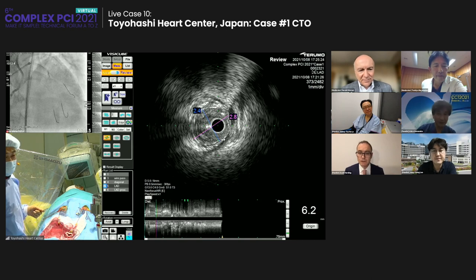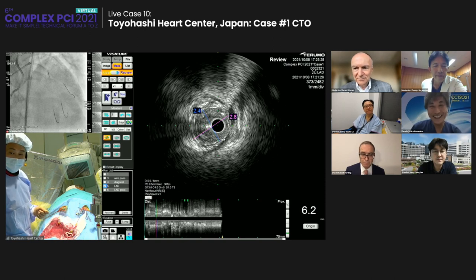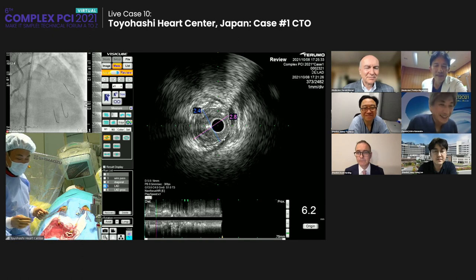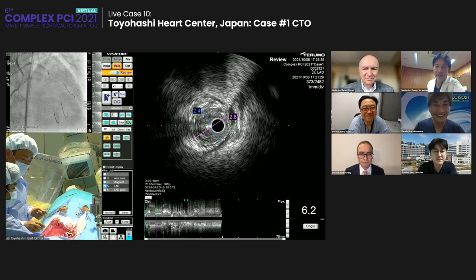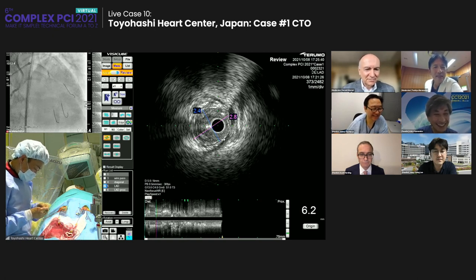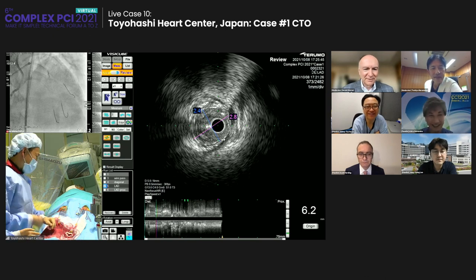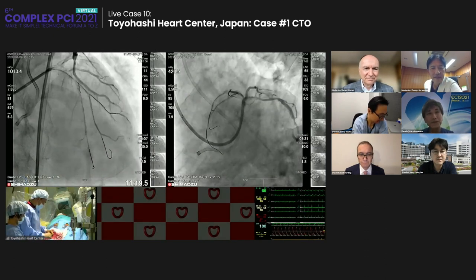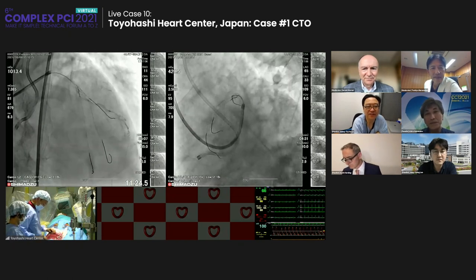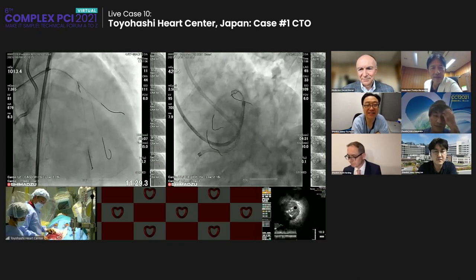So Hamanaka-sensei, do you still use the DCA often? Not often, but we are always looking for a case where the DCA can be done. Nowadays, the DCA is only available in Japan. So you are trying to avoid the stent there, right? Even after DCA, we may need a stent, I guess. Sometimes you do the DCA and DCB. But obviously, if it's a very big vessel, you can put a bigger stent in after the DCA.